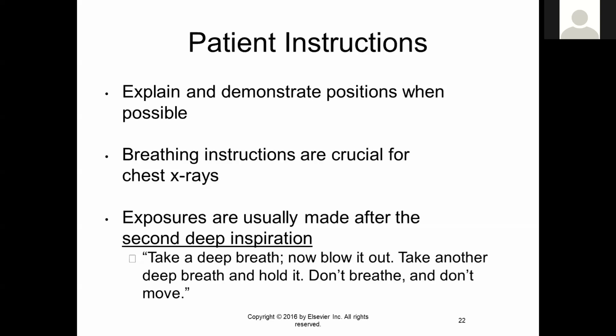Why do we do this for chest X-rays? Well, we want to see as much of the lungs as possible. If you just take a deep breath and hold it, you'll see a good amount of lung. But if you make 2 deep breaths, you will see more lung field. The diaphragm will shift lower. You've essentially primed it to open up a little bit more.